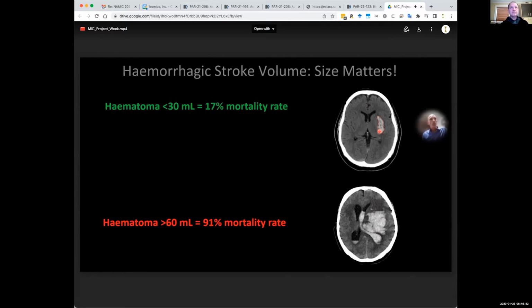And we know from very careful studies that were actually completed while I was in medical school, that if you measure the hematoma volume using something called planimetric measurements, you can predict mortality, and there are different thresholds for mortality and good outcome. Now, planimetric measurement is what clinicians call this. Most of you in the audience probably call this image segmentation.